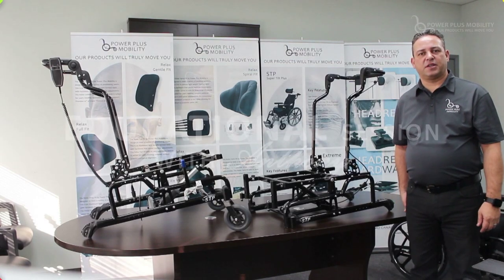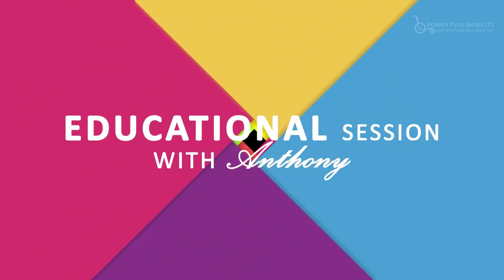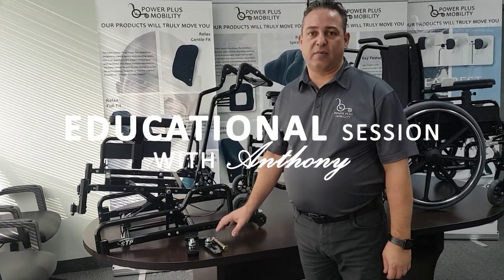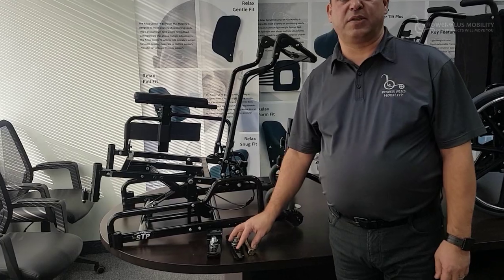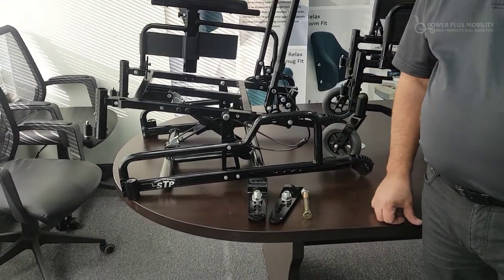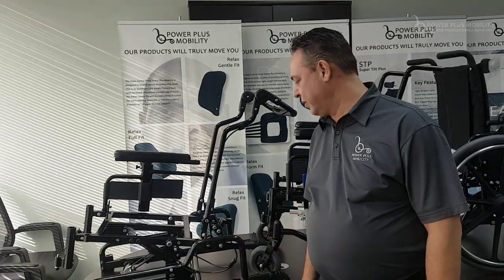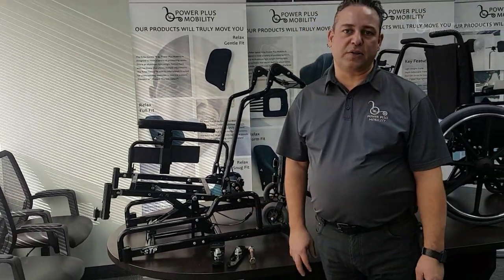Welcome to Power Plus Mobility's educational session. Today I have three different types of chairs and three different types of axle plates. First I'd like to address why we need rear axle adjustability on any one of these frames that we're going to show you here today.